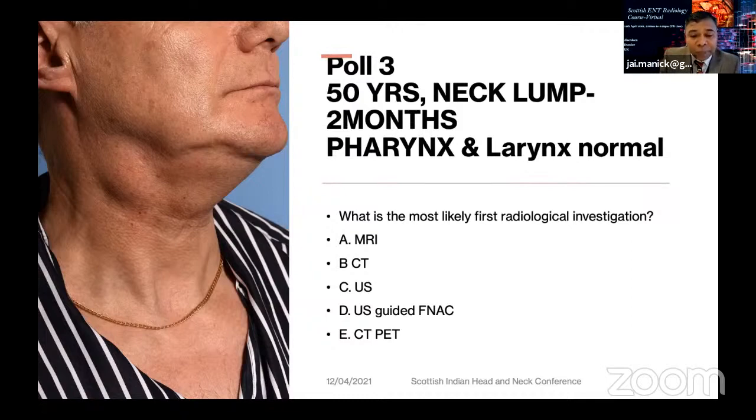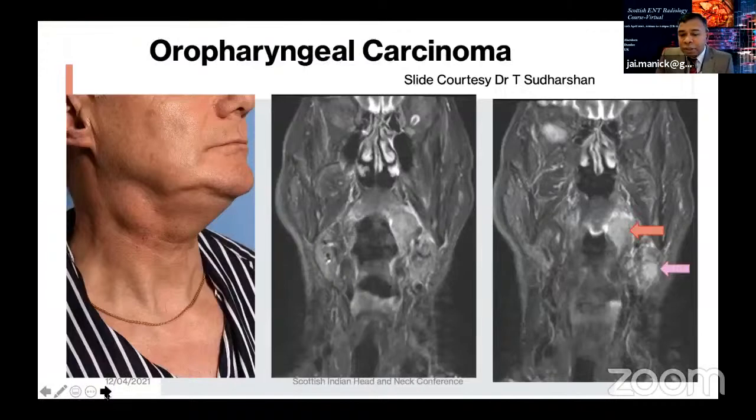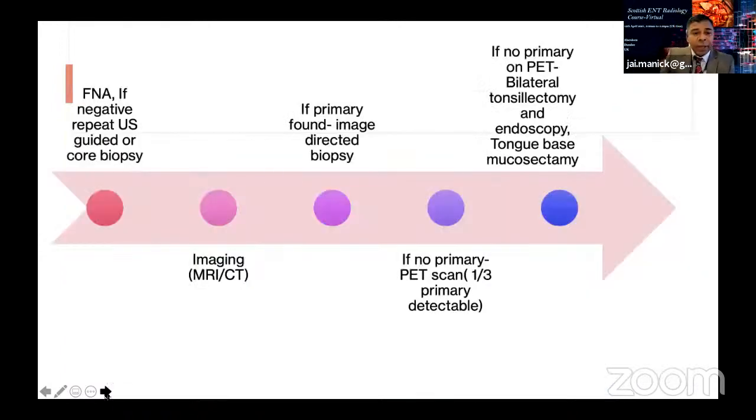Another option, if you have the facility, is ultrasound FNA, which is the gold standard because ultrasound adds more information, and FNA with ultrasound generally has a 10 to 20% higher hit rate compared to freehand FNA. It also tells you whether the lump is cystic or solid. So this is actually a tonsil primary with a metastatic neck node, which was not seen on clinical examination but was picked up by the MRI scan.